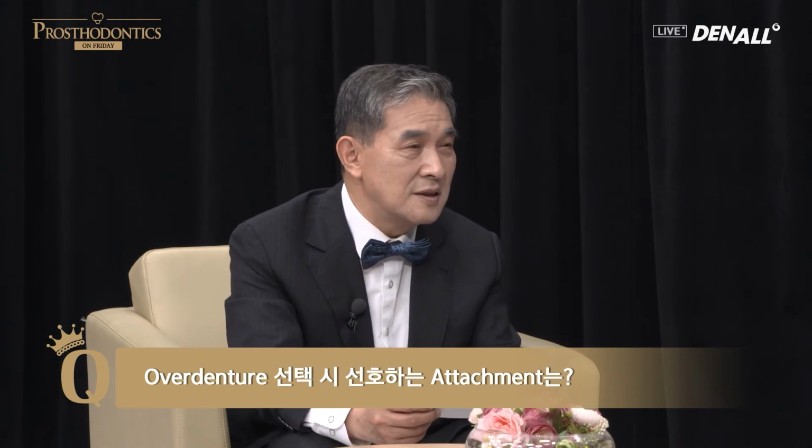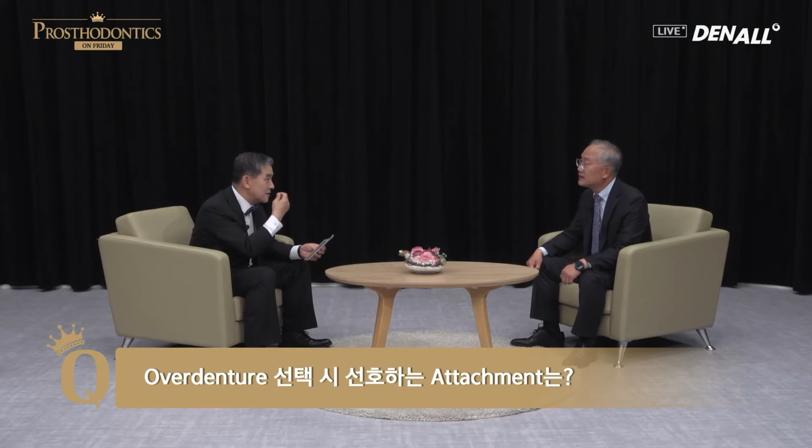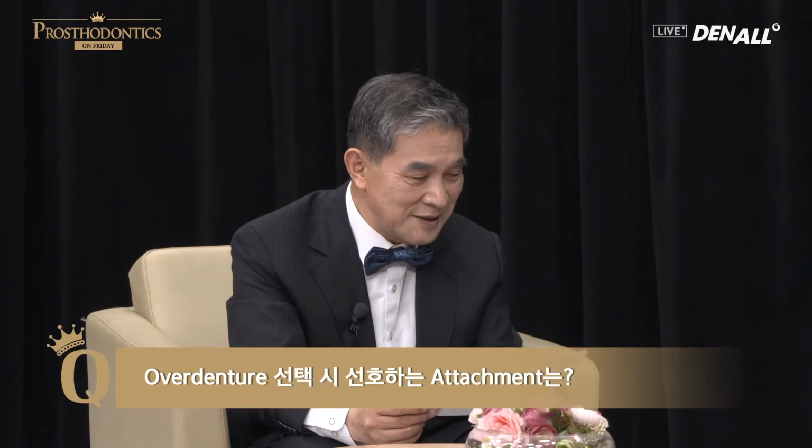In the papers that I've looked at, comparing bar and stud attachment, the patient satisfaction is higher in stud type, and a lot of papers say that. For bar type, the cleaning is an issue and it's difficult to find the right path, and there are multiple problems.